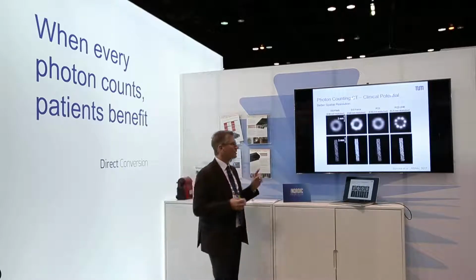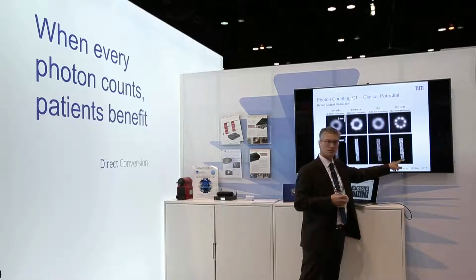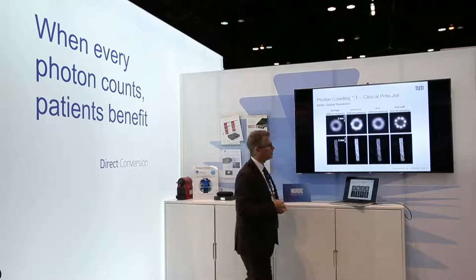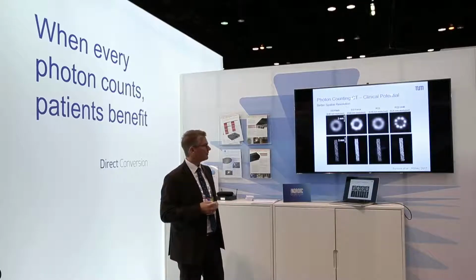That, of course, is sometimes not easy to couple with the energy resolution, because for the energy resolution you need a charge sharing compensation, and in that case it's probably not ideal to combine.